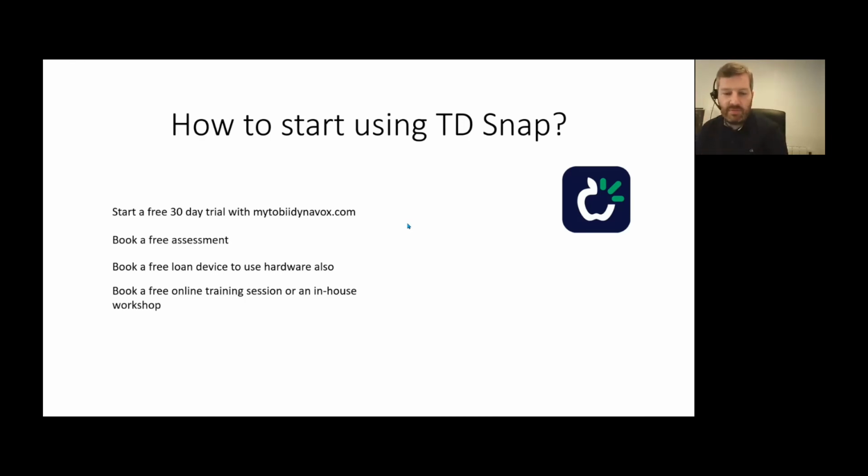As I said, today is more of an overview. If you want in-depth training on how to use this software, book a training session with us, and we'll happily take you through all the features and how you edit and how you do everything. Or if you're a team, we can do it online, or we can come to your center and train you up on how to use TD Snap.